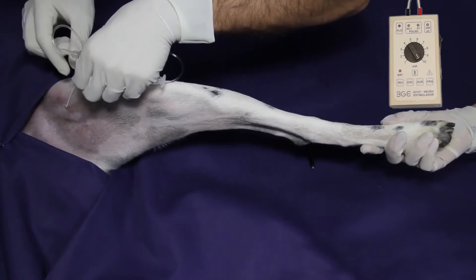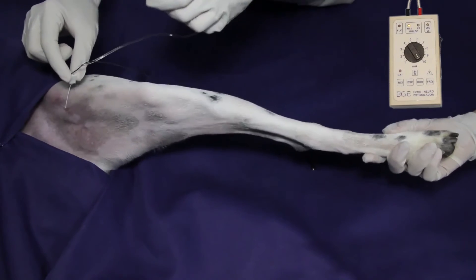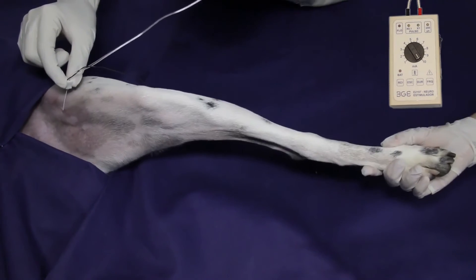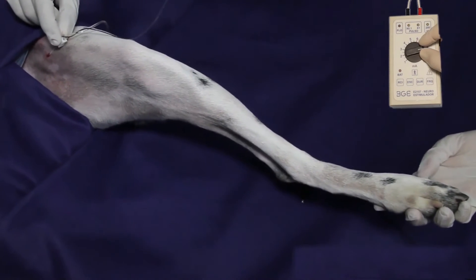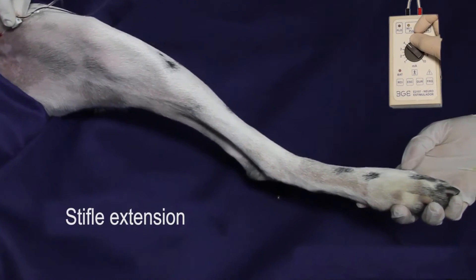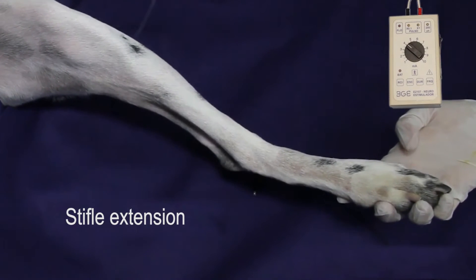The femoral nerve is identified distal to the iliopsoas muscle and medial to the sartorius muscle. Stifle extension occurs during stimulation of the femoral nerve.